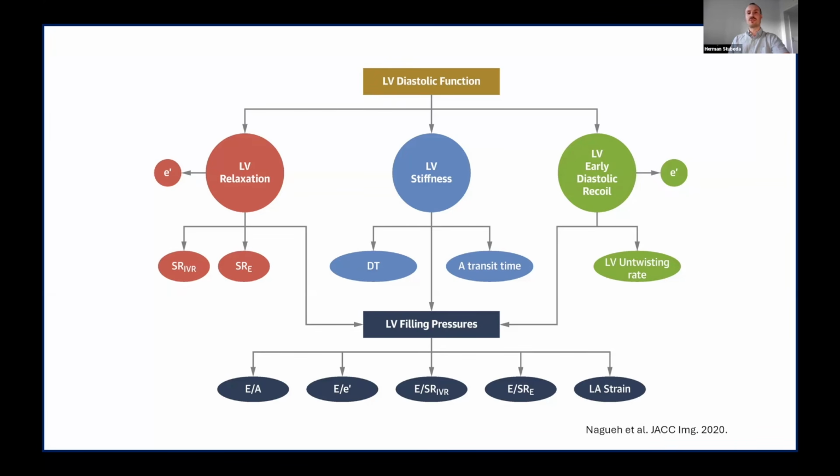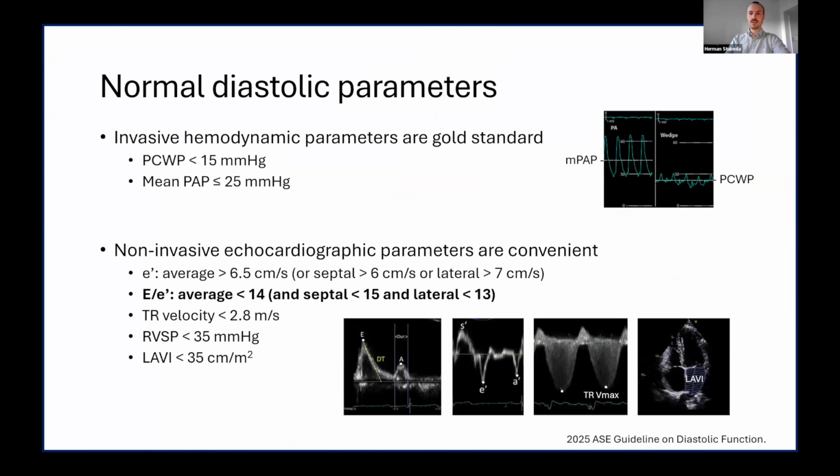Some of them, as I mentioned, are novel and don't yet have enough evidence to be in guidelines and protocols around the world. There's also an absence of standardized software packages for some of these more complicated parameters as well. But here are the parameters that are most well studied and accepted as markers of LV filling pressure, and they're also relatively easy to acquire and repeatable between operators.